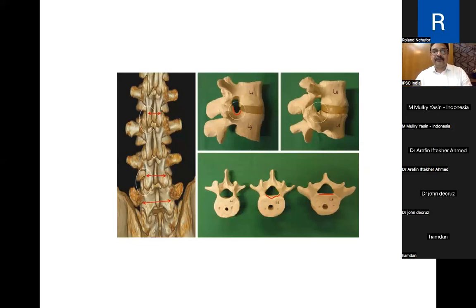So the first thing which comes to mind is that the initial few steps are all under fluoroscopy guidance. We know the limitation of fluoroscopy is that it's a two-dimensional image, so many times we have to imagine many things. We have to be very thorough in our anatomy, because what we cannot see on the fluoroscope is actually there. Many things we see very clearly on the fluoroscope are actually behind other bony tissues, and before reaching that area we have to cross other tissues also. So it is important to have good anatomical knowledge, and also fluoroscopic anatomy knowledge.